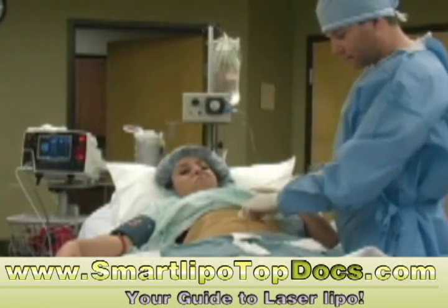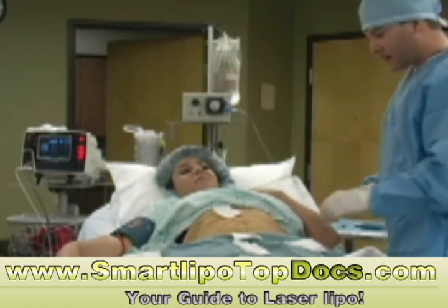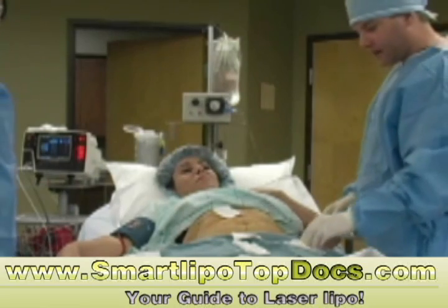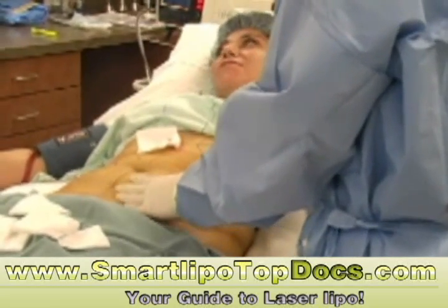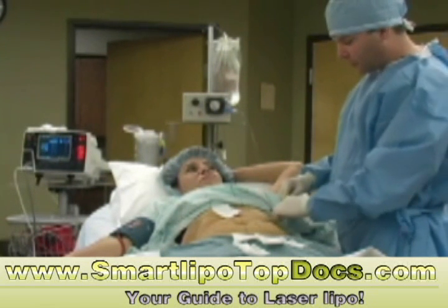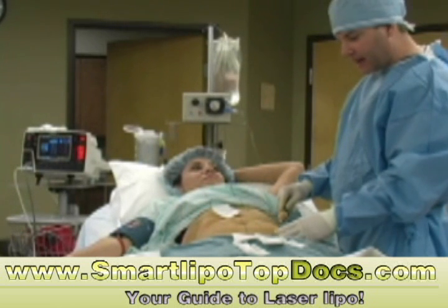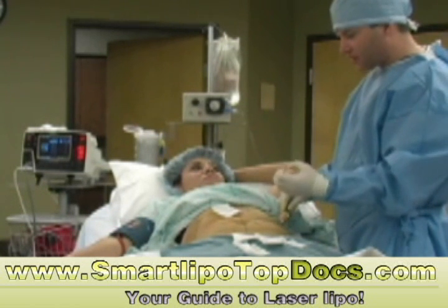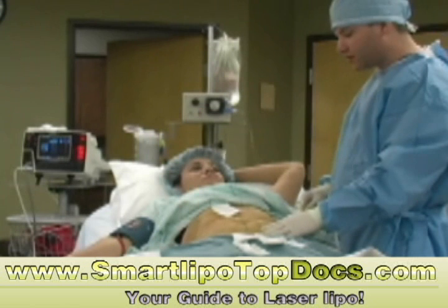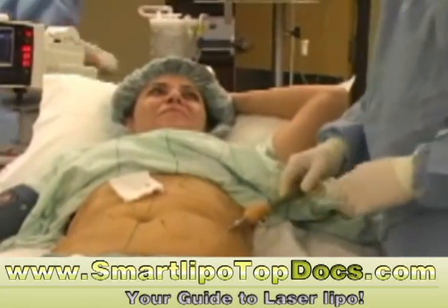You shouldn't be feeling this at all. We're going to start filling you up with the local anesthesia that we talked about. We'll be doing this for the next 15 or 20 minutes, and you'll feel a little pinch here and there — maybe a little burn — but only a minimal amount of discomfort, if any. This local anesthesia does two things: number one, it provides more than adequate anesthesia so you're not going to feel anything. But equally important, it constricts or shuts down all of your tiny little blood vessels, so there's just a minimal amount of blood loss — on the order of maybe one to two teaspoons. Most females lose more in one day of a menstrual cycle than they lose with one of these tumescent liposuction procedures. That means there's minimal post-operative bruising and minimal post-operative pain.